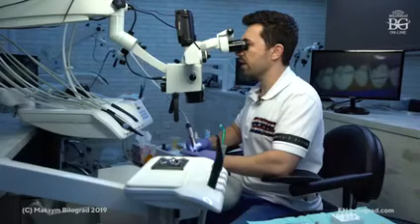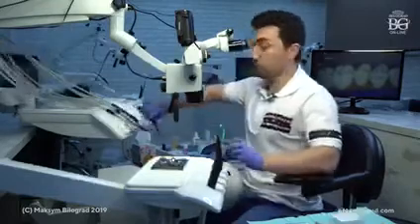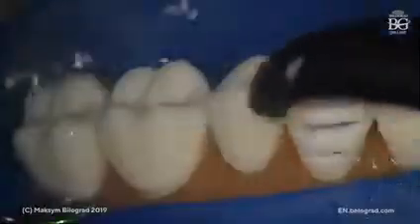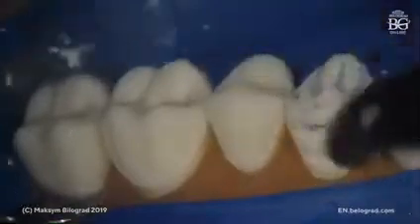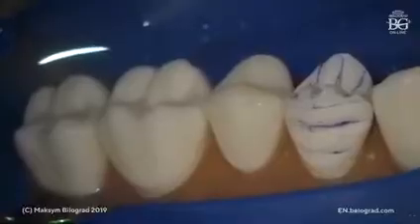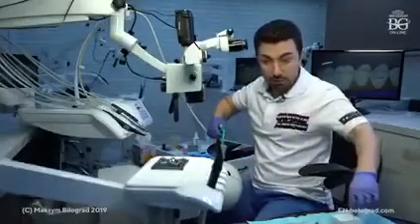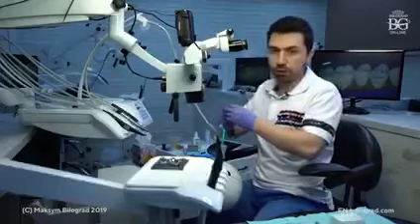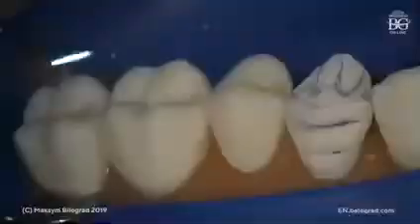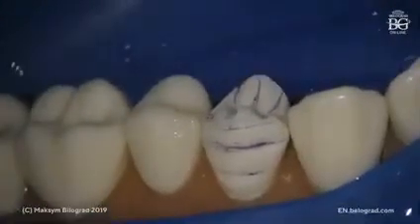Okay, and actually we're done with the partial occlusal reduction case. It's a butt joint. We will go now to the first premolar, and you can see that I have prepped all the occlusal surface. I'm changing the burr now. I will use the one that we will utilize for occlusal reduction. This one will make it easier to prep the palatal side.